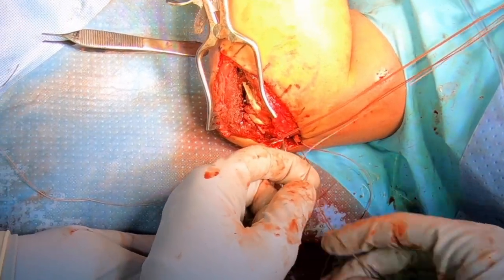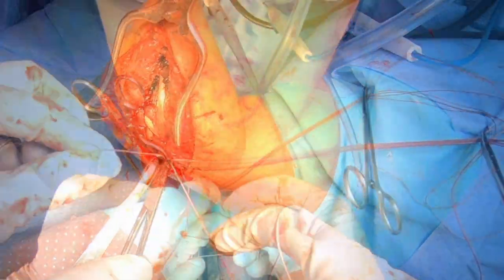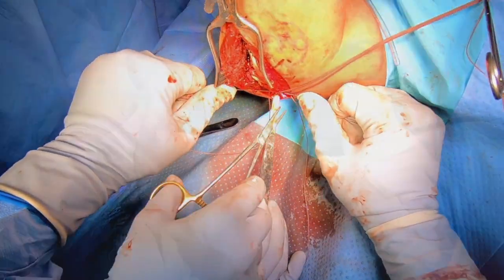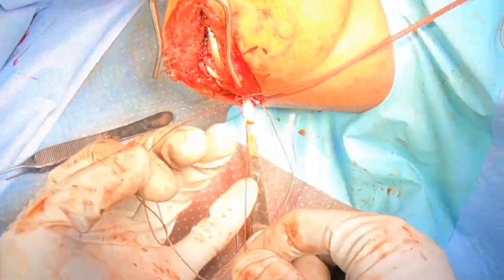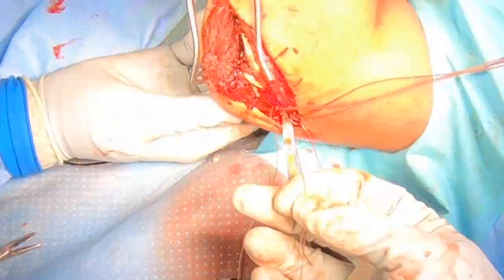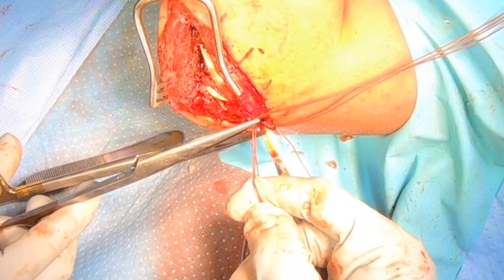Now we're going to tie our ligament repair sutures to completely stabilize the elbow. You see me there carefully tying — we'll even use a clamp to make sure the knot is perfectly tight. We put in six knots on top of this to make sure it's totally, absolutely, completely stable. Once those are completely in, we'll cut that suture. And that's our ligament repair first suture placed.